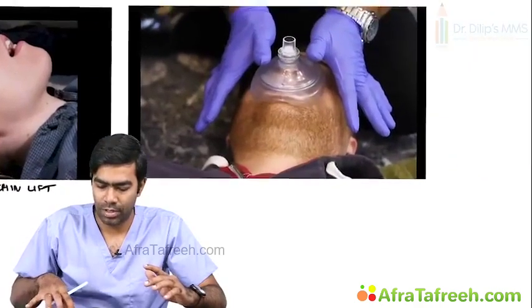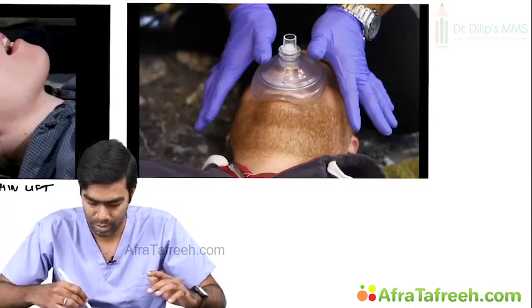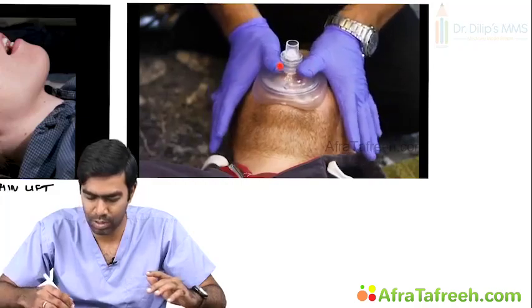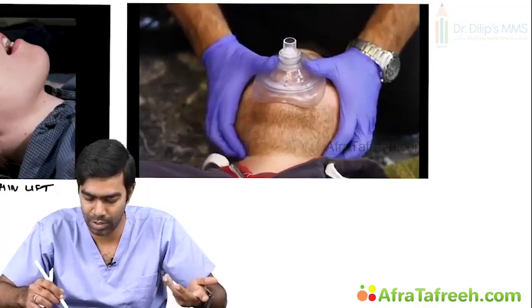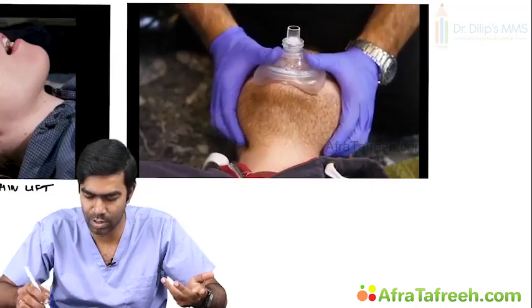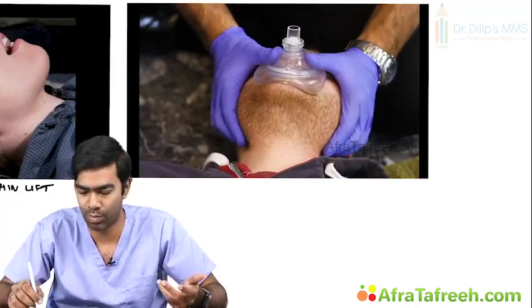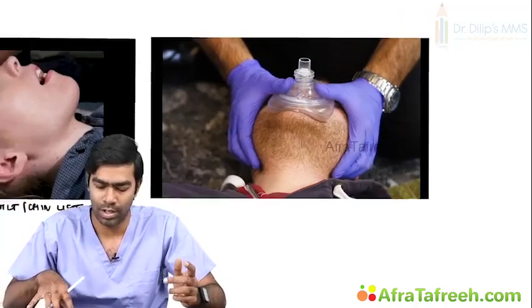Then let us see how you are going to do a jaw thrust maneuver. In a jaw thrust maneuver, you can see here he's placing his thumb over the mask in this case, otherwise it will be on the zygomatic arch. And he's just using the fingers to lift the mandible up. He's pushing the angle of the mandible forward. So it's a very easy technique. This is what we call a jaw thrust maneuver.